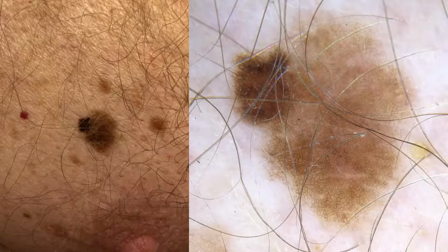So in this lesion where we only have brown colors, different shades of course, and a slightly atypical network in terms of the distribution and color, perhaps the thickness of the lines, a melanoma in situ. Another lesion that's flat, only two colors, brown and black, with irregular hyperpigmented areas, again, a melanoma in situ. One more flat lesion, again, only brown tones, and we have angulated lines. Of course, this is an extrafacial lentigo maligna, so melanoma in situ.